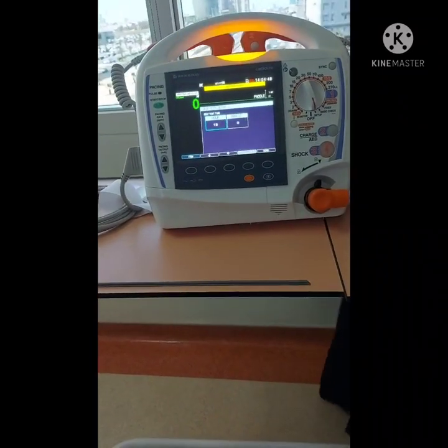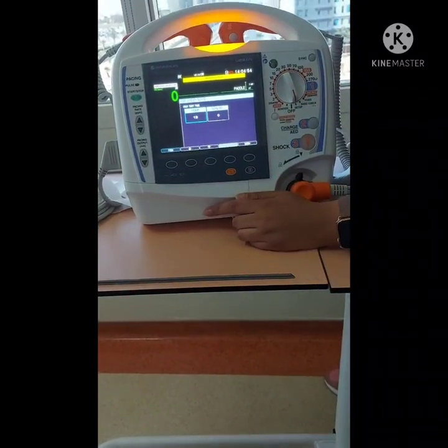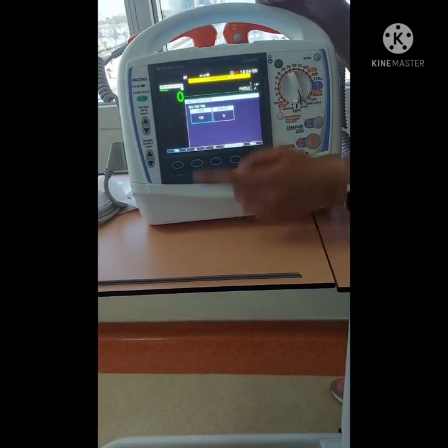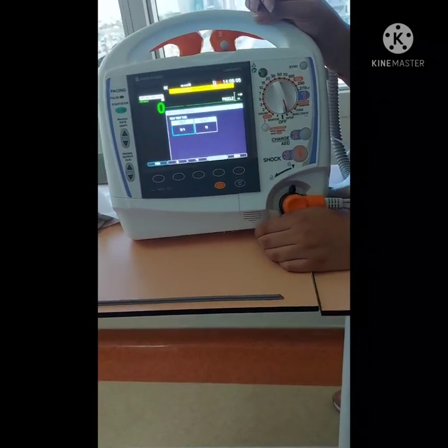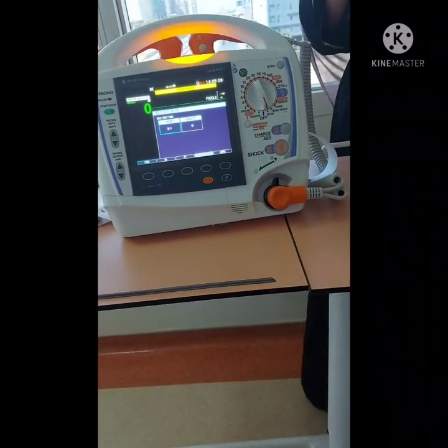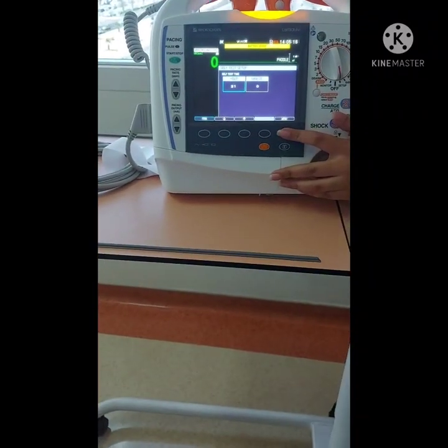Okay, nice. No need to put it. So you can choose. You cannot choose a specific time, but you can choose how many hours. Like now, 12 hours. Maybe you can increase it, it's up to you. 12 hours every shift. So we will start this one at 7 o'clock. Then we will set it at 12 hours. So every 7 o'clock, it will test. Yeah, exactly. But it will test if it's on, and if it's off.